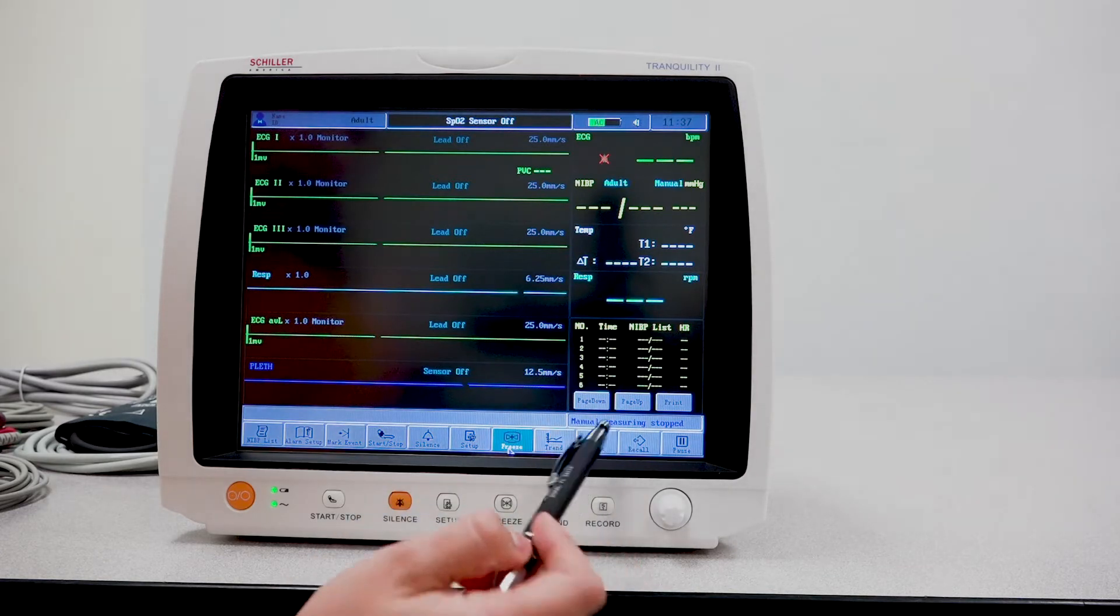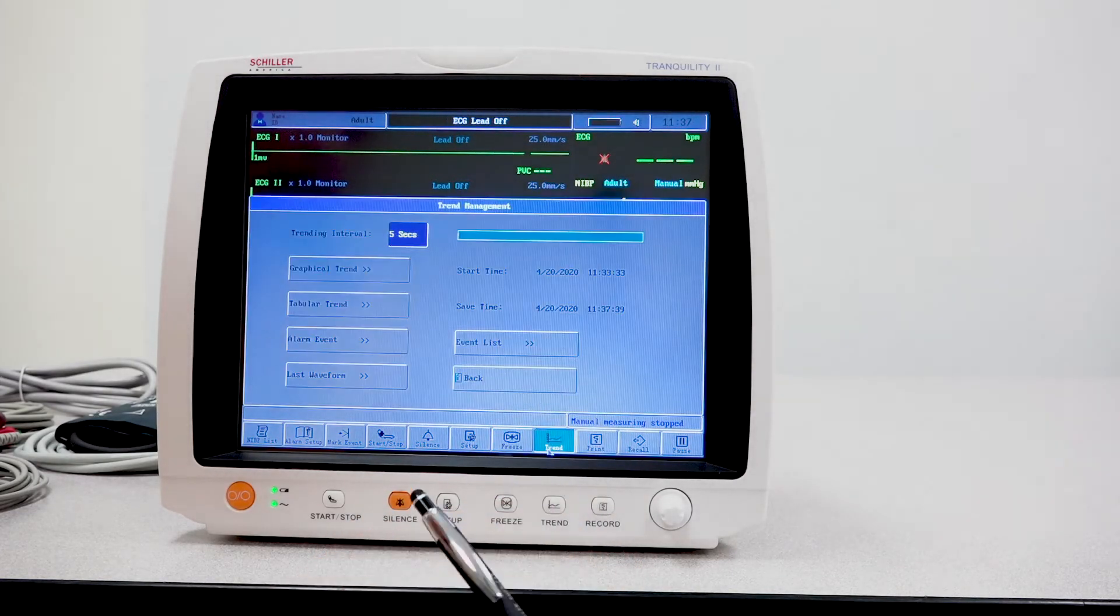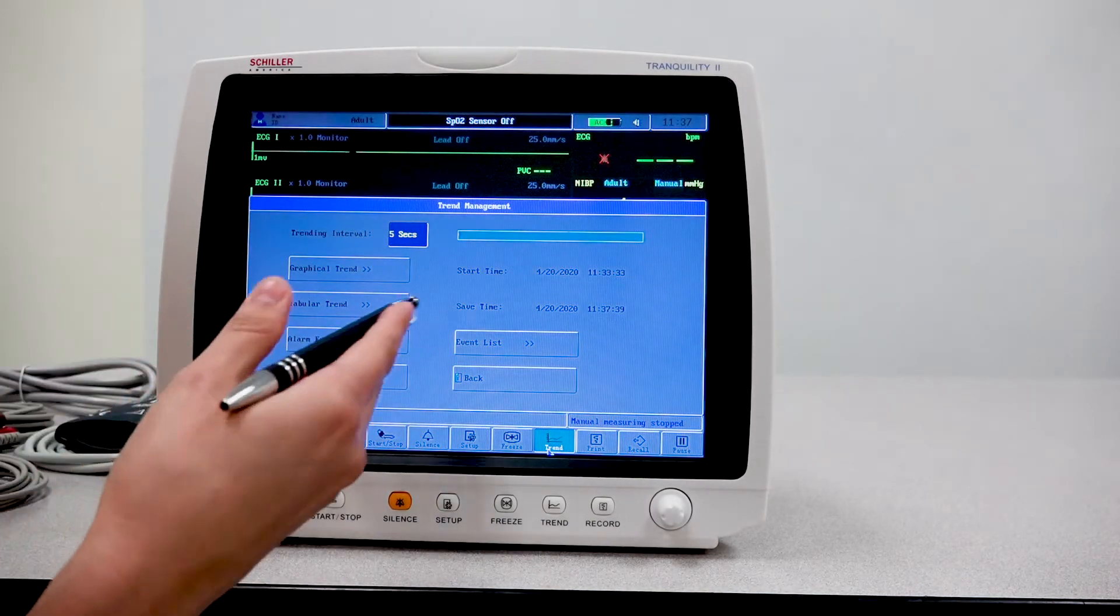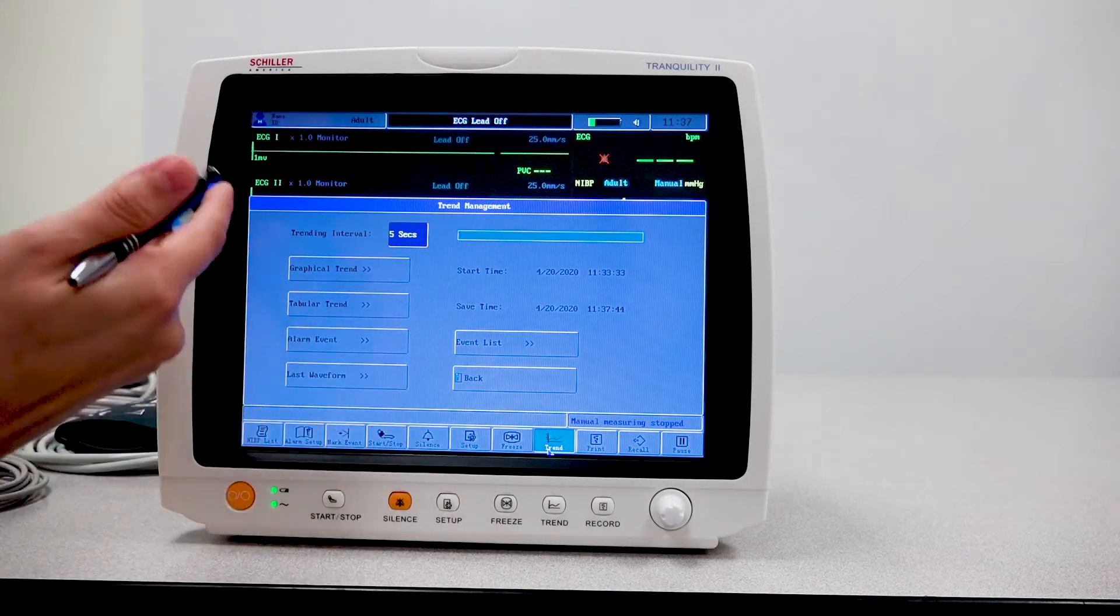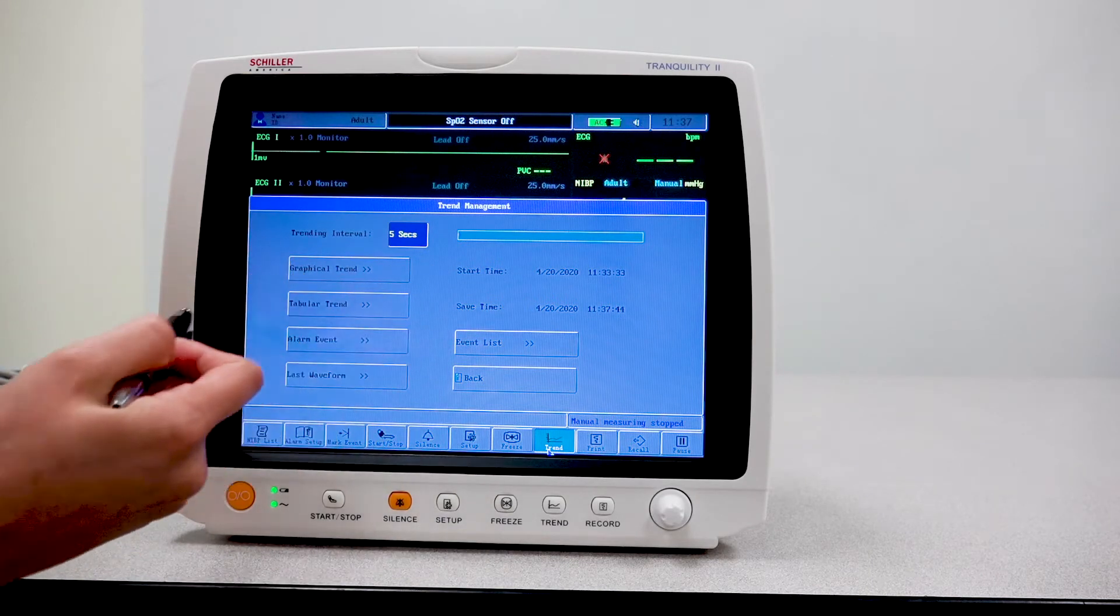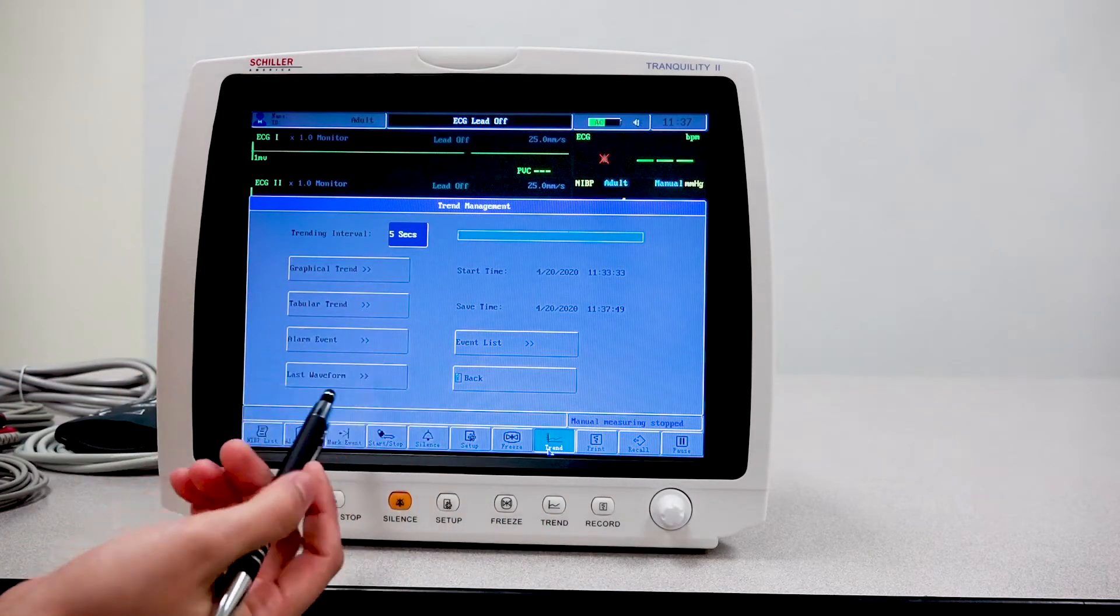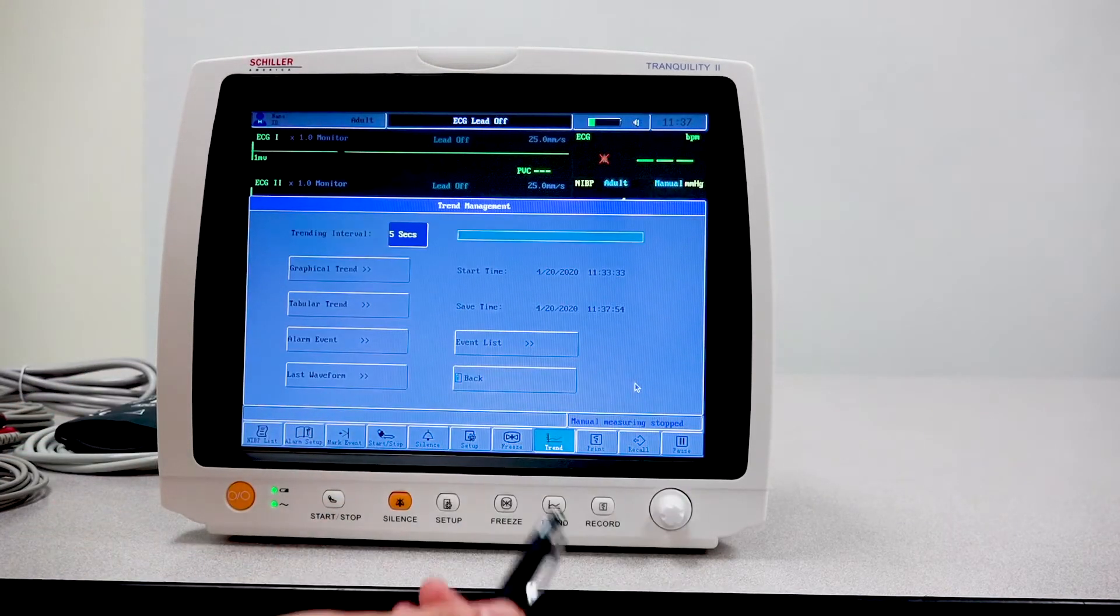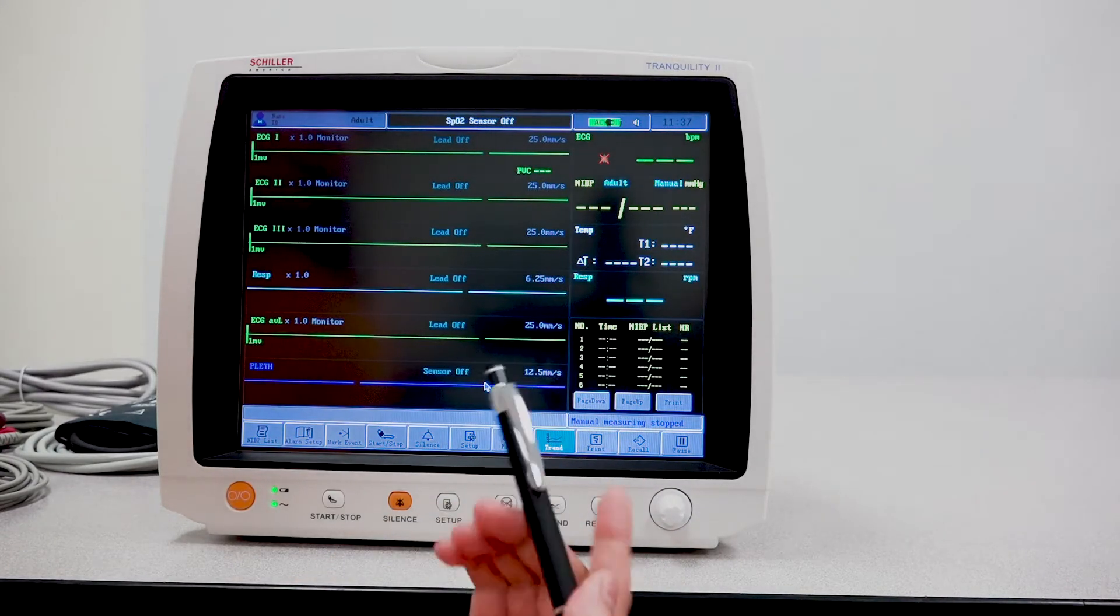You also have the trend button, which you will be able to configure the different settings for the trend as you would like to see it, whether it's the graphical trend, the tabular trend, an alarm event, and for how long.